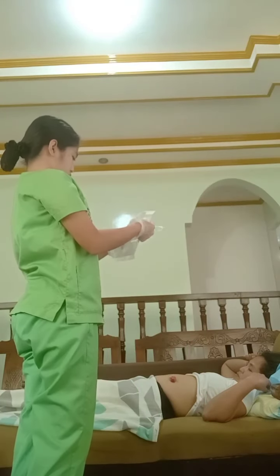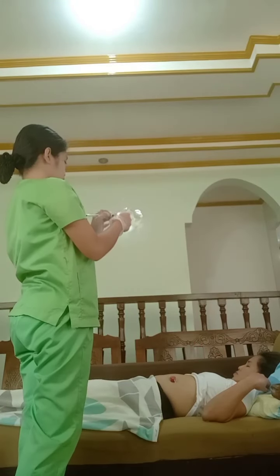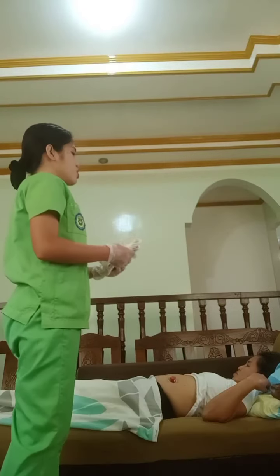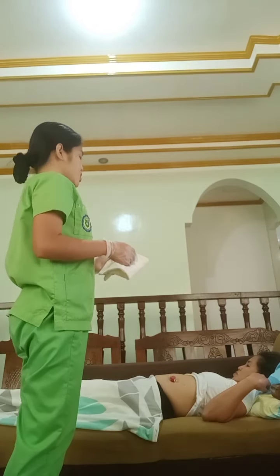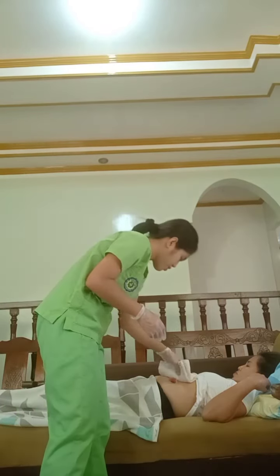And then trace using a pen. And then now, using a clean cloth with mild soap, we will cleanse the peristomal skin as well as the surrounding area, and then rinse it using warm water to prevent irritation on the area.